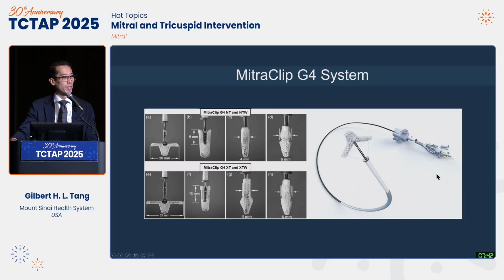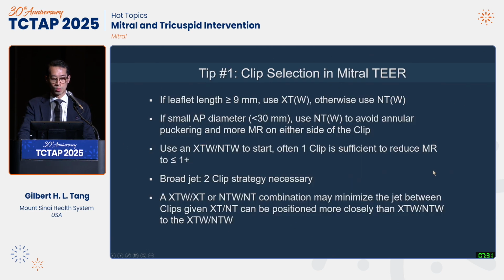Thanks very much to the organizer for inviting me to give a talk on streamlining the workflow of mitral TEER, because people still think it's a very difficult procedure, but I can see in Professor Takashi's live case earlier, it took only 5 minutes for him to do the procedure. So the MitraClip G4 system, you can see here, has 4 different device sizes available for optimal grasping.